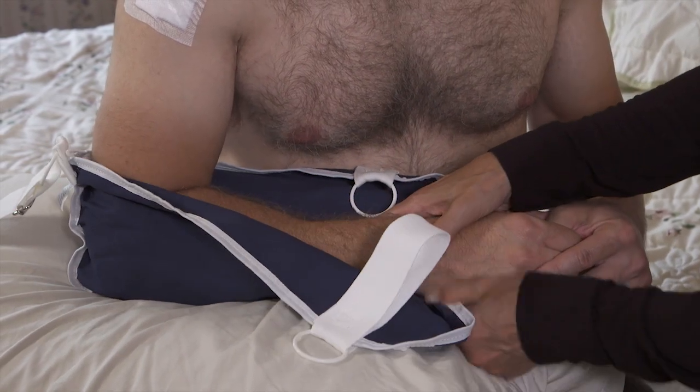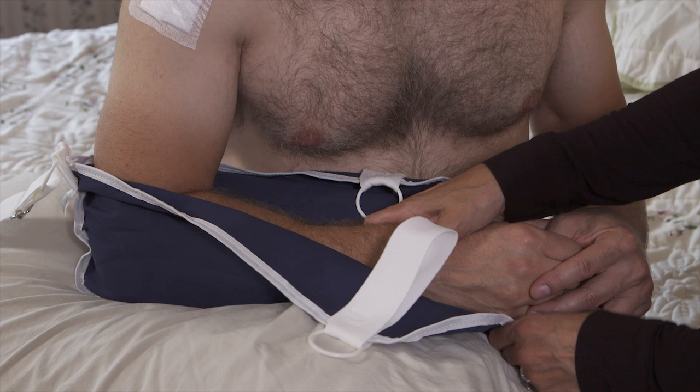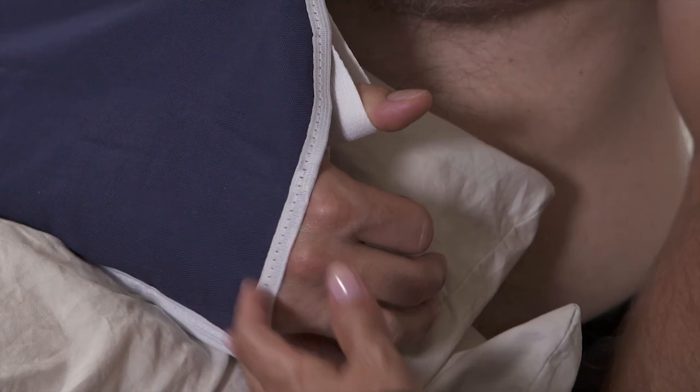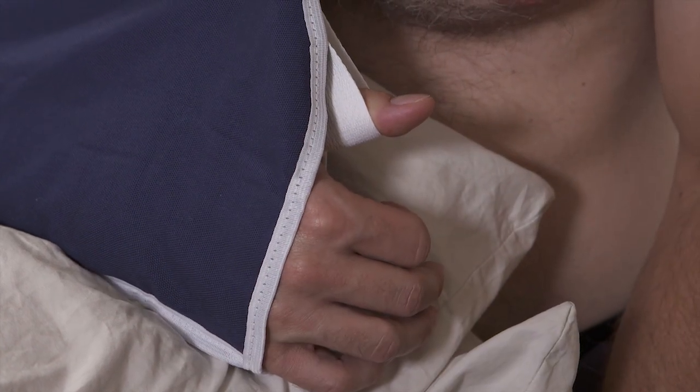You may hold your wrist or hand to help keep your arm from moving. Do not move your healing shoulder or your arm. Just relax. Your helper makes sure your elbow is in place at the end of the sling. There's a loop in the sling for your thumb to help hold your arm in place. Use this loop if it feels comfortable.